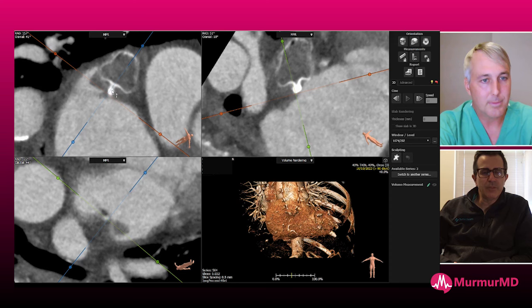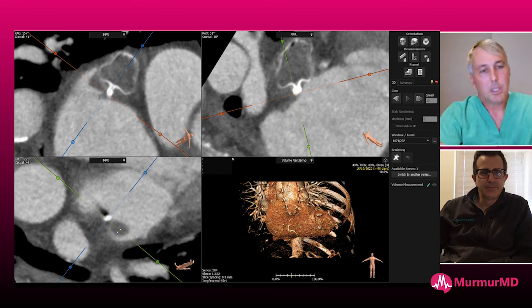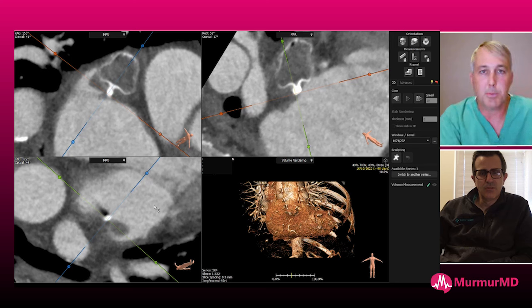So are you doing your first post-procedure imaging off anticoagulation? So our protocol is every patient at least gets DAPT after their implant. If a patient has chronic atrial fibrillation, or we see a lot of smoke in the appendage during the case, we will consider doing anticoagulation until they get their study.